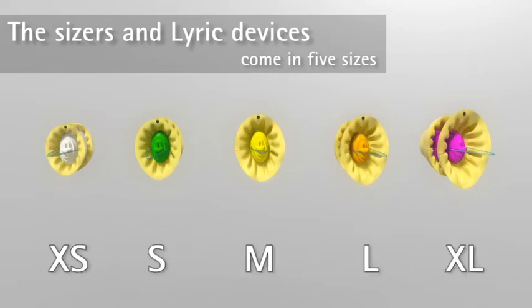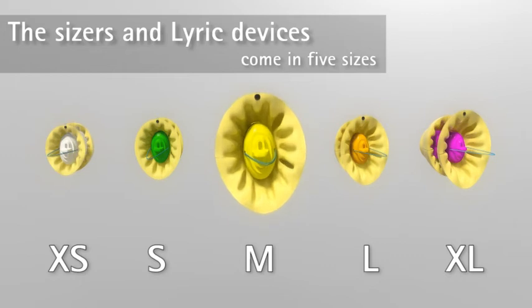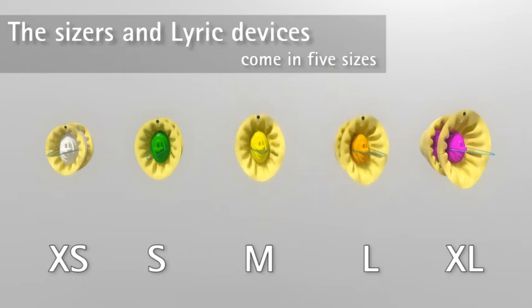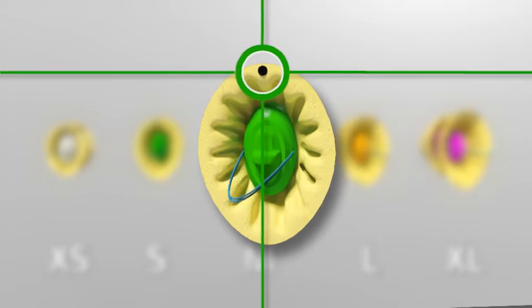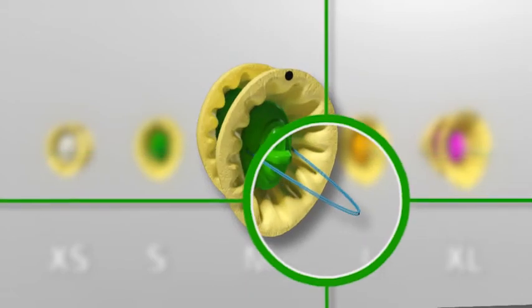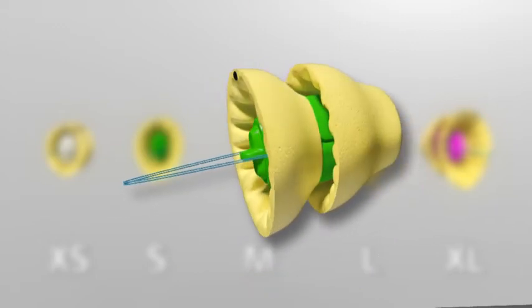Note that the extra small sizer has a white core, the small sizer has a green core, the medium sizer has a yellow core, the large sizer has an orange core, and the extra large sizer has a purple core. They have a black dot indicating the superior position in the canal, a handle and removal loops which are used for loading and retaining the device on the insertion tool and for removal.